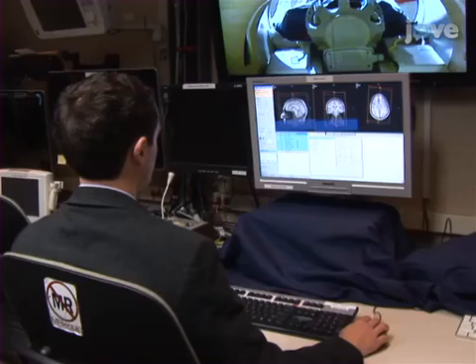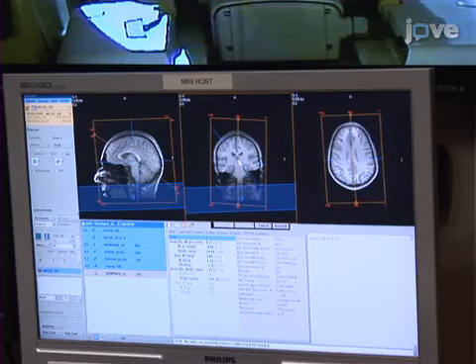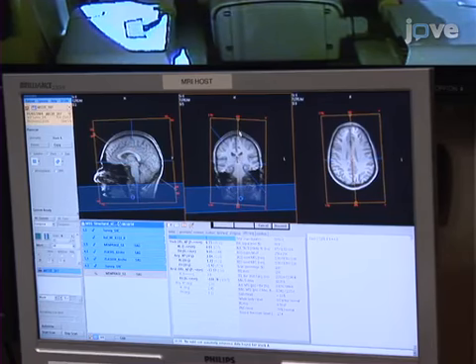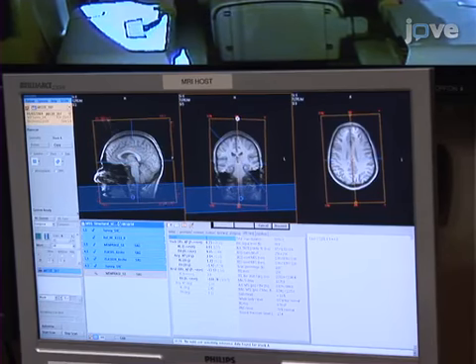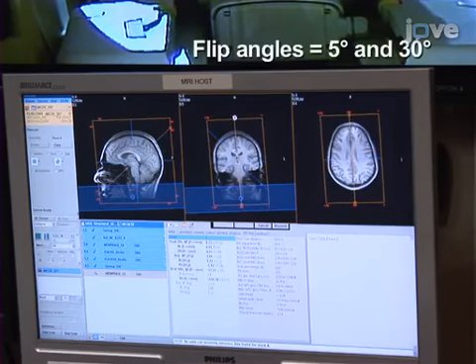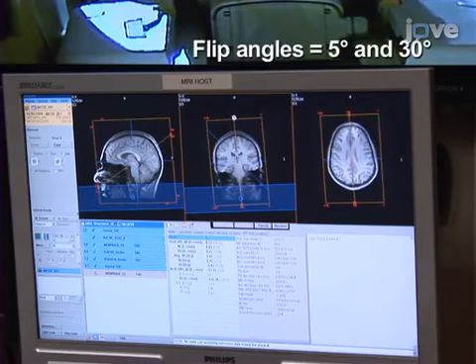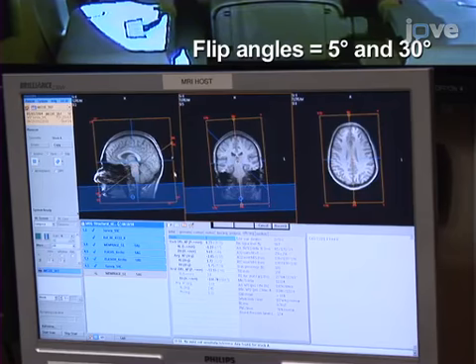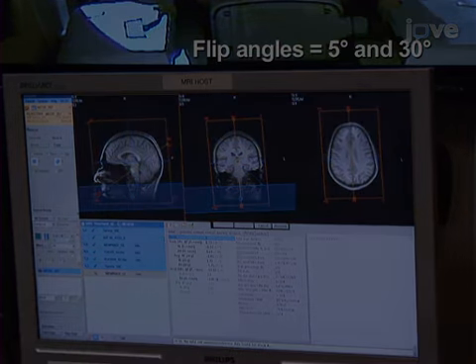If EEG data will be used for inverse imaging analysis, also acquire two fast low angle shot, or FLASH, MRI scans. These FLASH sequences provide different tissue contrast from the standard MP-rage sequences.